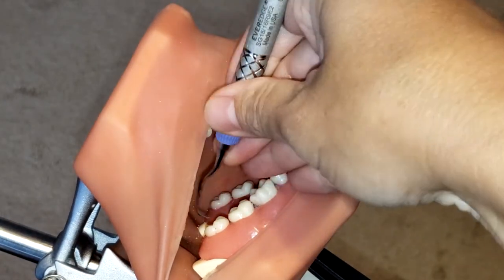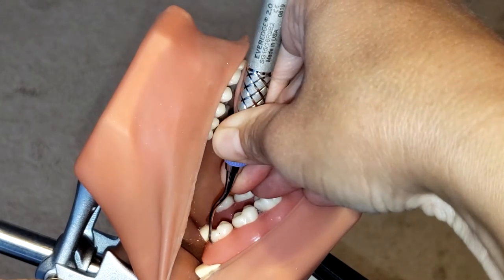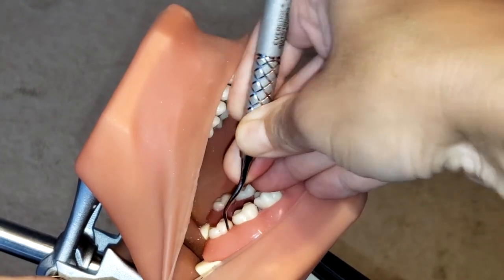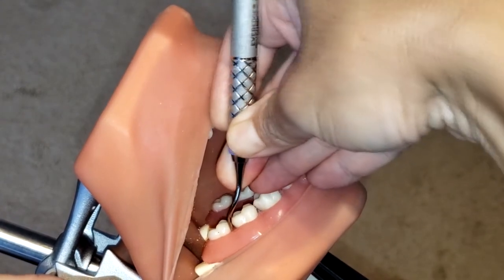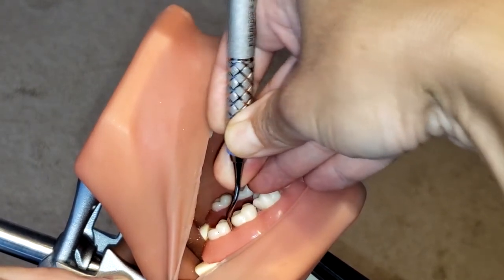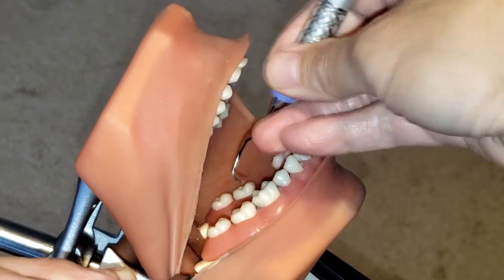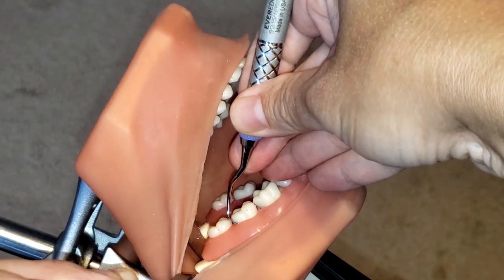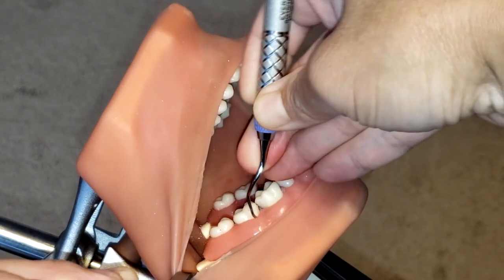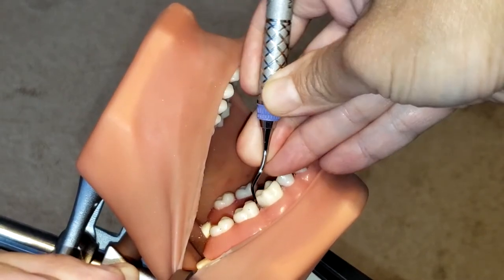I'm going to start at the distal line angle and insert the instrument into the pocket, then activate the instrument, making sure I am keeping the lower shank as parallel as possible to the long axis of the tooth. Rock on your fulcrum so that you can get that 70 to 80 degree angulation for calculus removal as you go into the interproximal space. This is a subgingival instrument, so stay subgingival, use overlapping strokes, nice and controlled, going straight into that interproximal space.